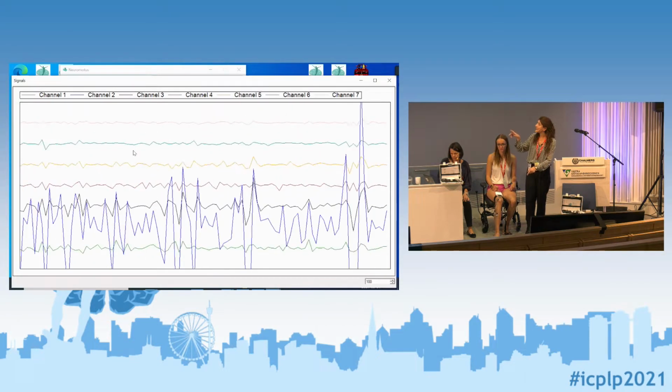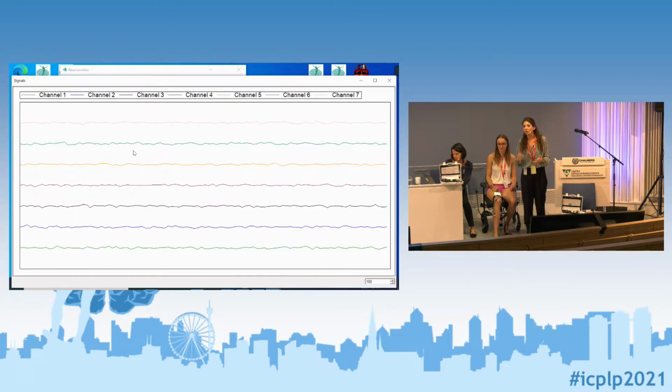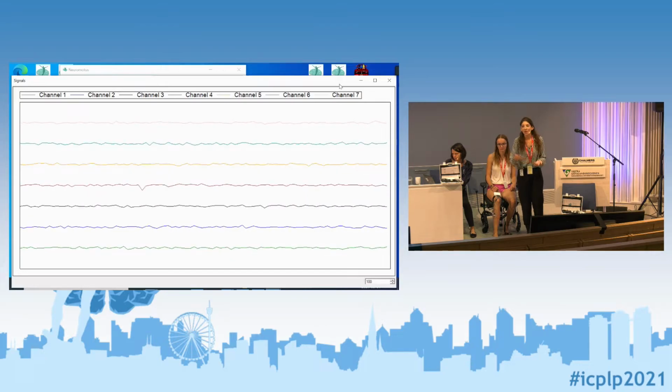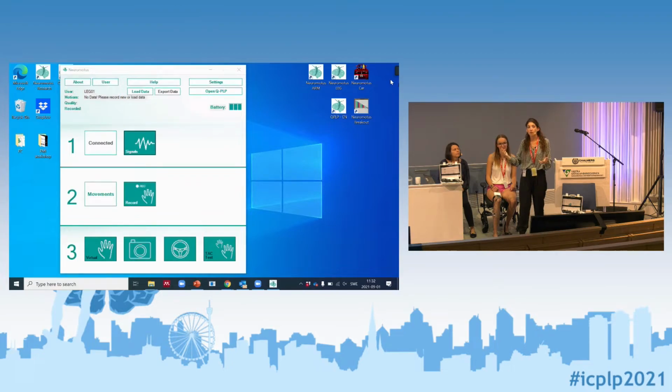As you may see, Mirka is doing a strong contraction, but it's a problem to do a strong contraction. Why? Imagine if your patient starts the recording session doing the maximal effort, then the rest of the session will probably be fatiguing. Normally a session could be 2 hours, so it's quite a lot of time for them to pay attention. So we normally ask them to do a contraction of around 60 to 70% of effort.